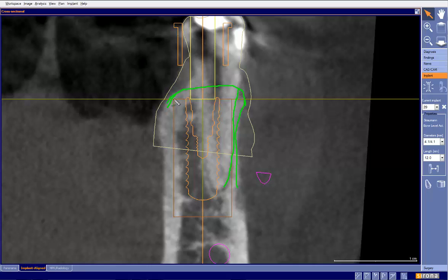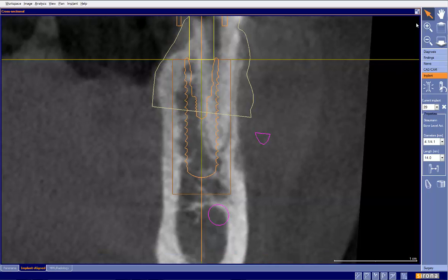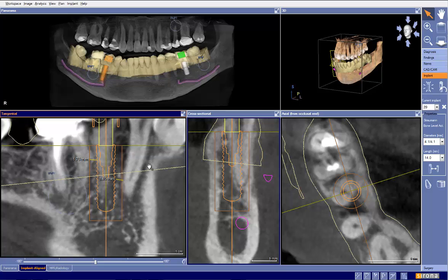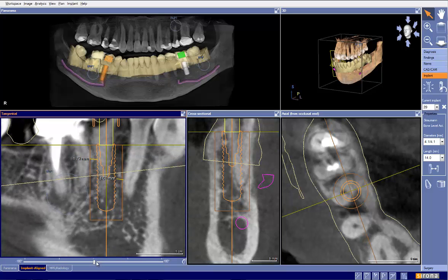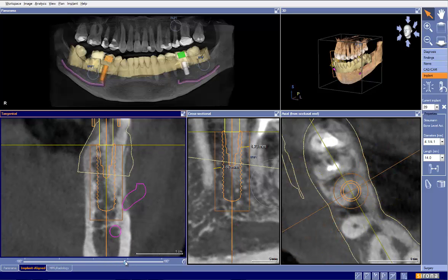Just like so. If we outline the rest of the tooth, what we can see is our implant is in quite a bit of nice, quote unquote, fresh bone to provide us stability. So I'm pretty happy with that. Again, we have the ability in this particular case to extend a little bit apical. We do have some concerns about the location of that in comparison to the mental foramen, because right here we can see the mental foramen. So we are pretty close right there.